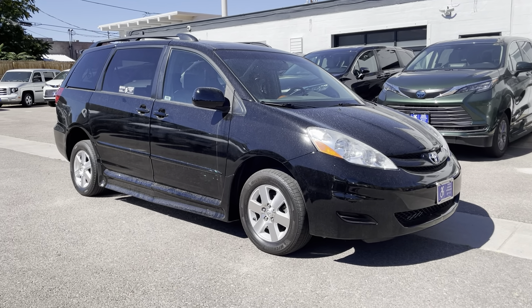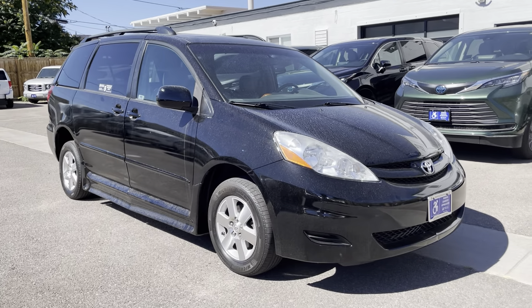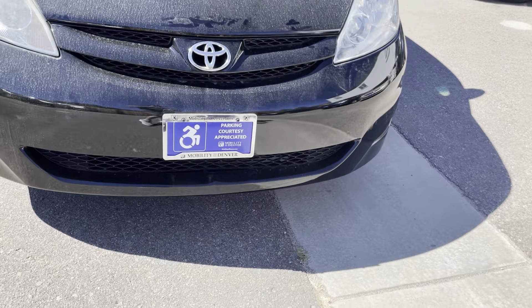Hello. This is a walk-around demonstration video on the 2008 Toyota Sienna with the Braun Ability Conversion. I'll point out any items as we come across them as we're looking around the car.